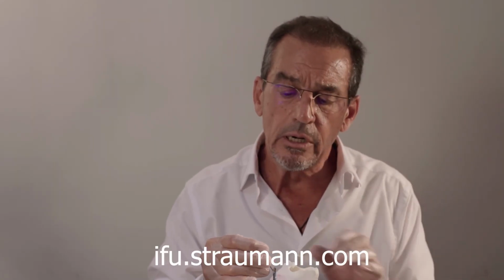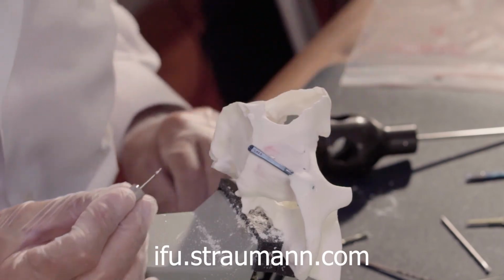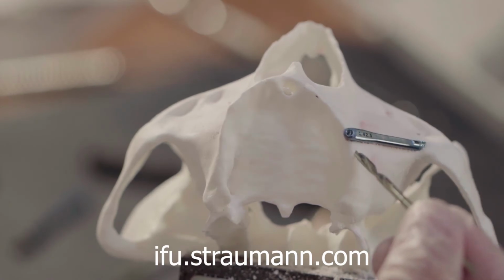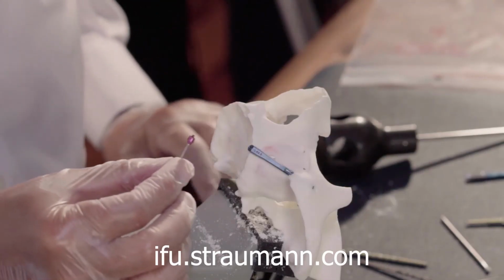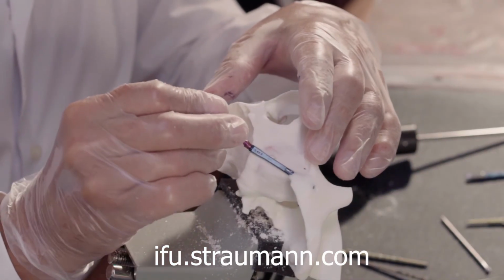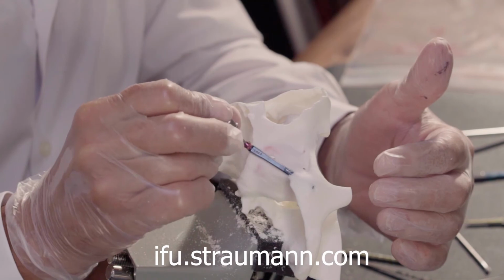It's fine. We will place an abutment. So now we move like this. So you may see now the implant head is on the top of the ridge. So the prosthetical direction is the ideal one. Now we will use this specially designed Zygomatic abutment that fits totally into the Straumann screwdriver.